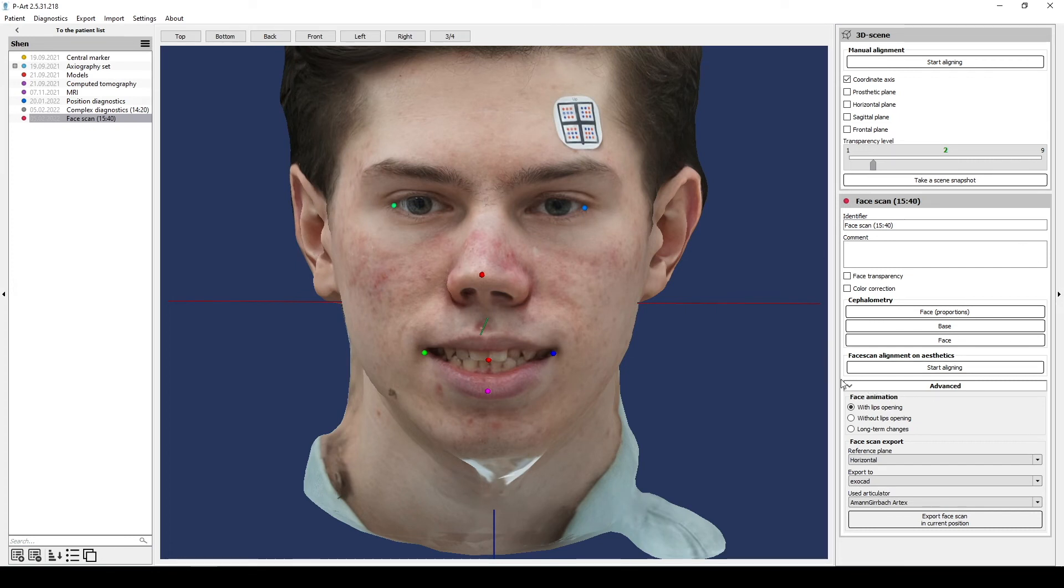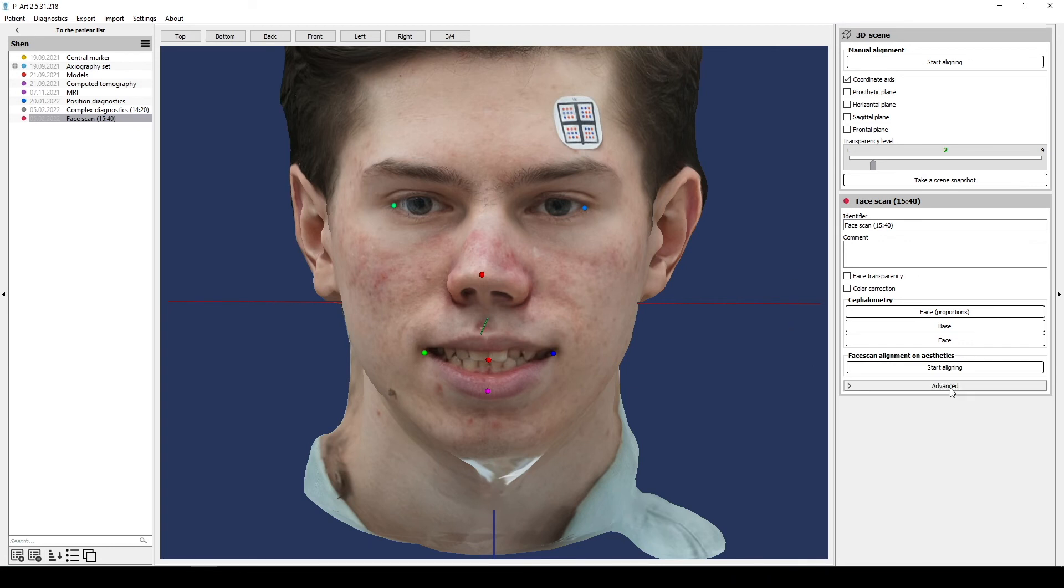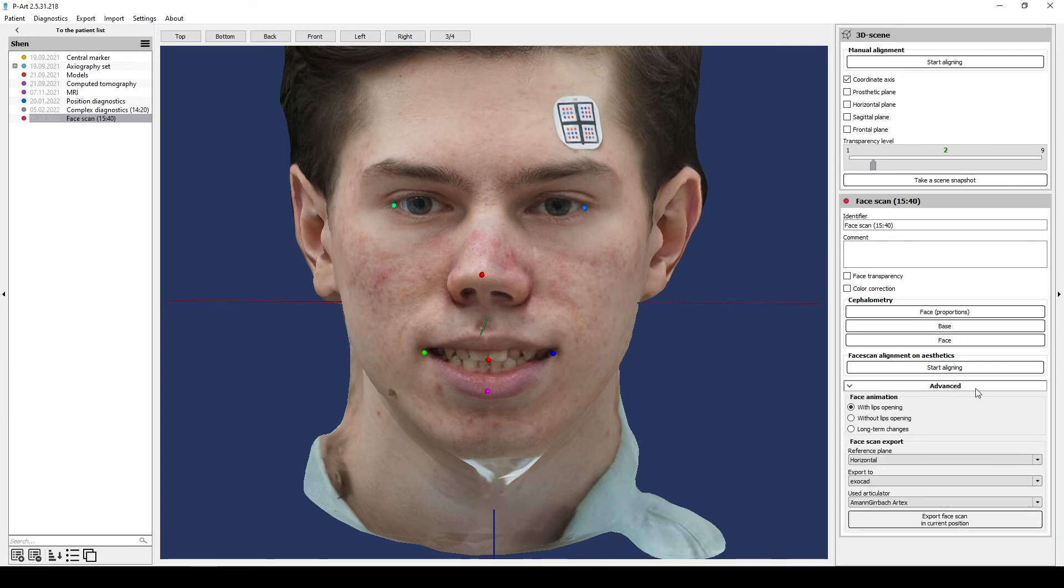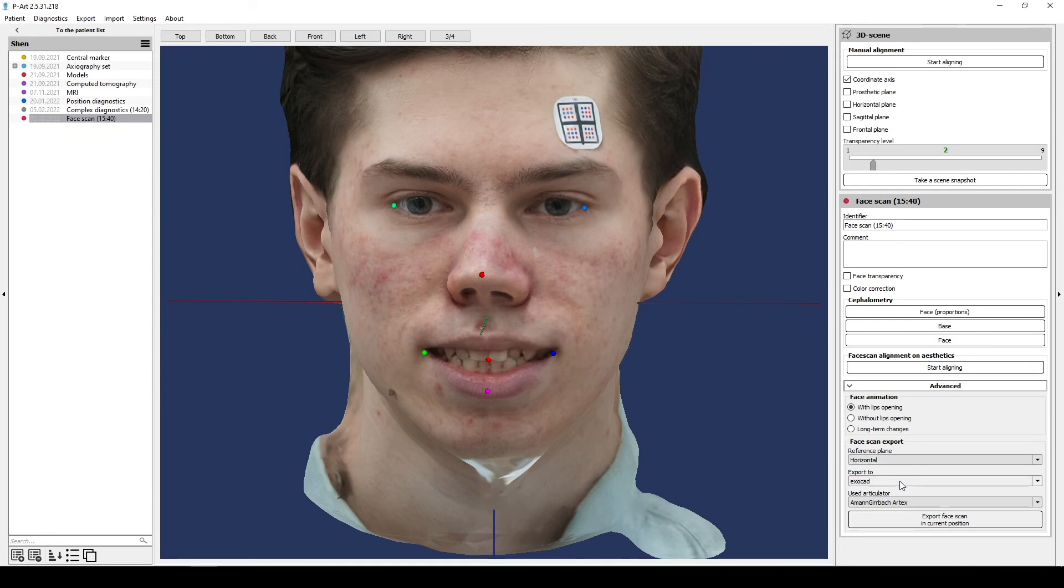And select subsection Advanced and select Export parameters: Occlusal plane, Program and used articulator in current position. The settings must be the same with individual model parameters.